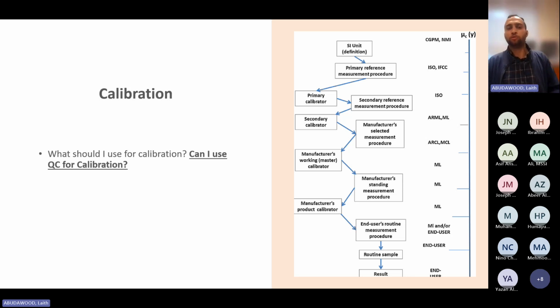So for example, WHO prepares or sells something called an international reference preparation, IRP. Now, WHO simply has a method that science, as far as we know, produced and is the most accurate method, for example, to determine factor 8 concentration, okay? We know it's so accurate that it only has a margin of error like 0.1%, for example. I'm just giving random numbers here.